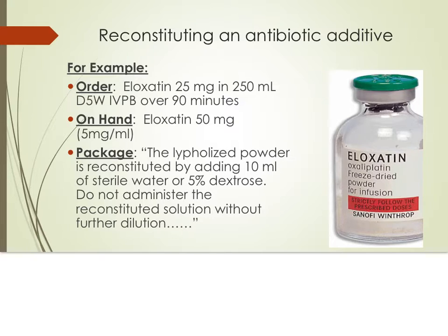Sometimes it takes several minutes for the powder to completely dissolve. Do not continue until the powder is completely dissolved. If this is a multi-use vial, immediately label the vial with the date, time, and diluent used to reconstitute. Be sure to read the package insert to see how long the medication is good for after reconstitution.